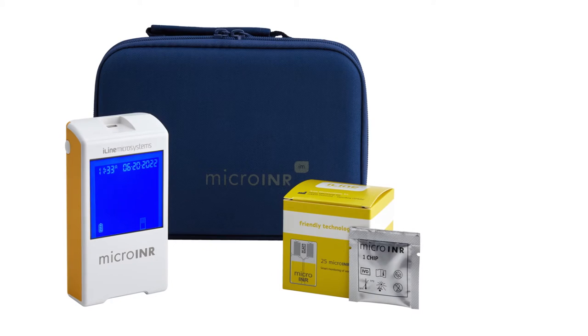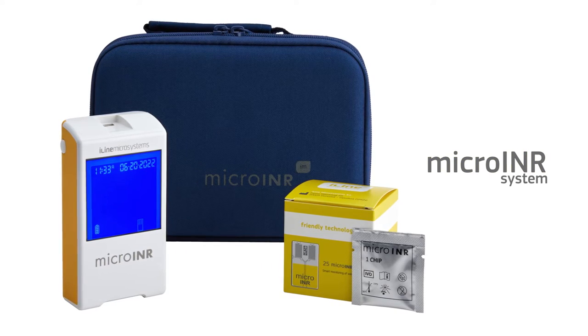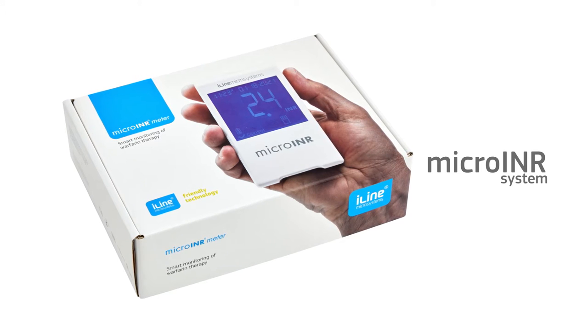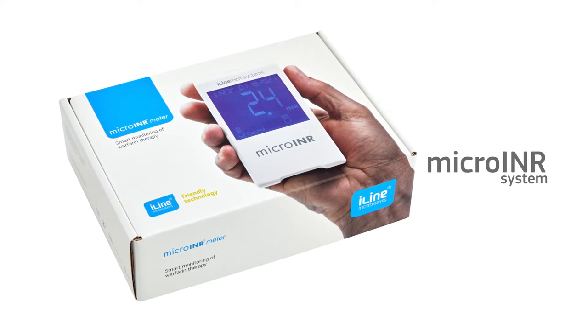The Micro-INR system measures prothrombin time expressed in INR units for monitoring oral anticoagulant therapy with warfarin. The Micro-INR system is intended both for patient self-testing and healthcare professionals at point-of-care settings.